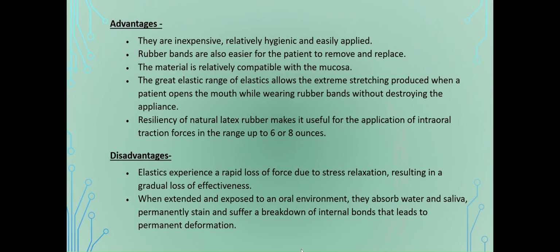Advantages: these are inexpensive, relatively hygienic, and easily applied. Rubber bands are also easier for the patients to remove and replace. The material is relatively compatible with the mucosa. The great elastic range of elastics allow the extreme stretching produced when a patient opens the mouth while wearing the rubber bands without destroying the appliance. Resilience of natural latex rubber makes it useful for the application of intraoral traction forces in the range up to 6 to 8 ounces.